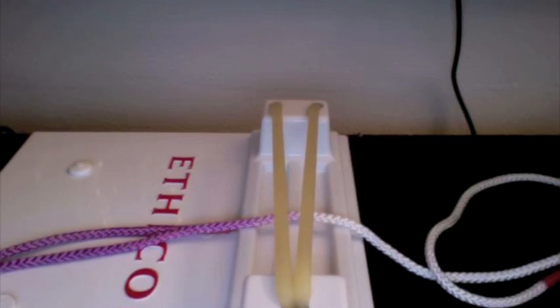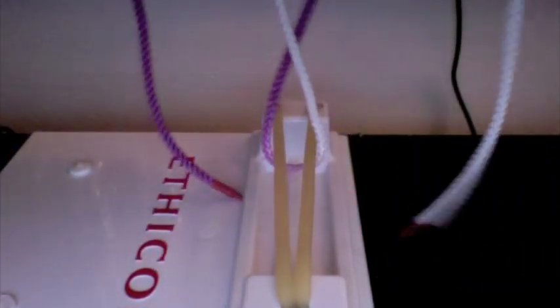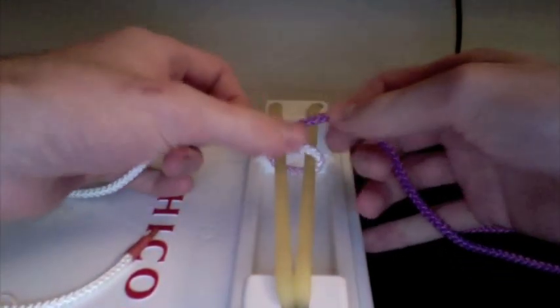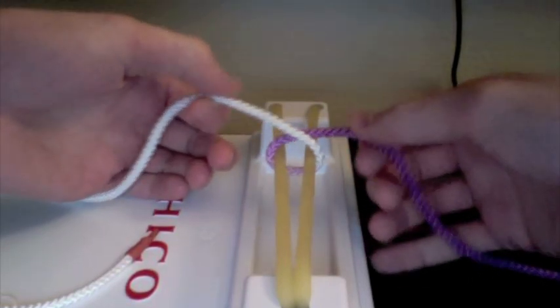The way you're going to set this up is right before you do anything else, you're going to cross these over the top so that the white is now going to the left and the purple is going to your right. You'll notice that the white is actually coming closer to you in front of the purple strand. This is how you're going to be set up.